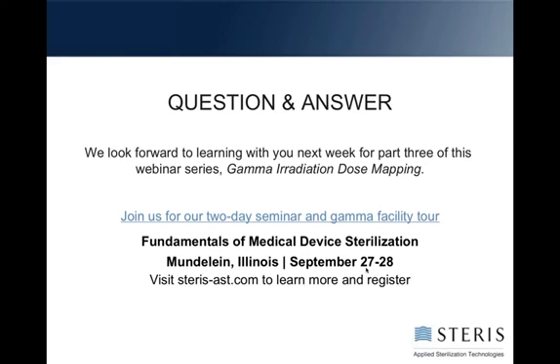Because what happens if it's only like 15%? That's a huge correction factor, more than double. And you could be coming up with numbers that don't really make sense. But bottom line, it means you're not accurately representing your bioburden, and the bioburden is what's driving your sterilization dose.